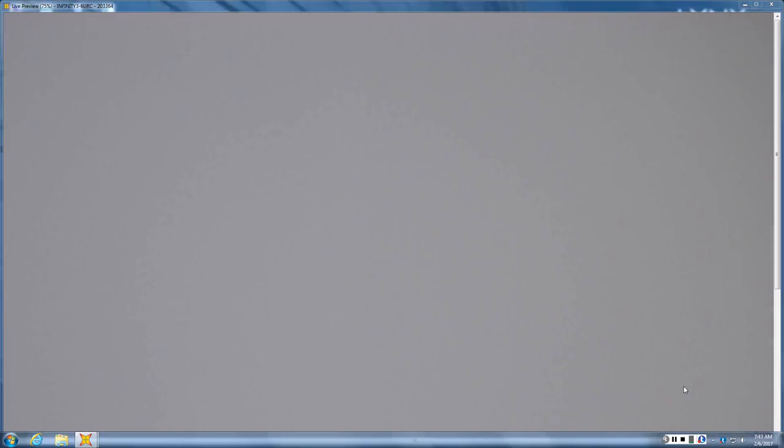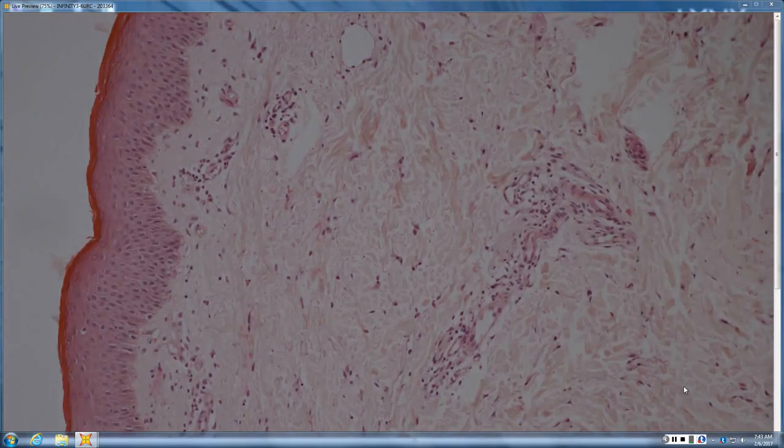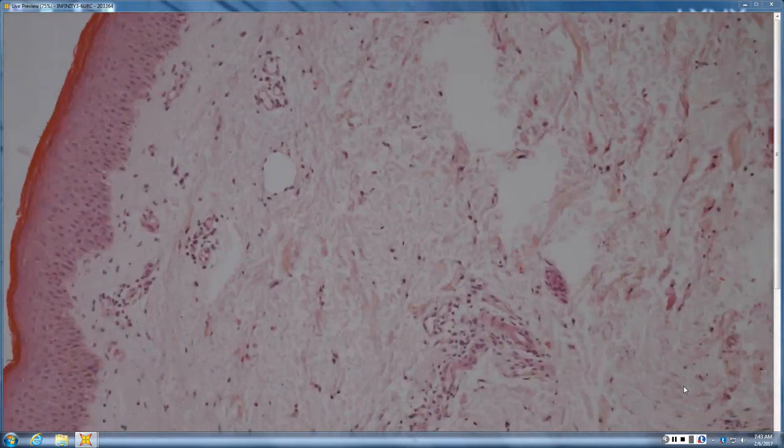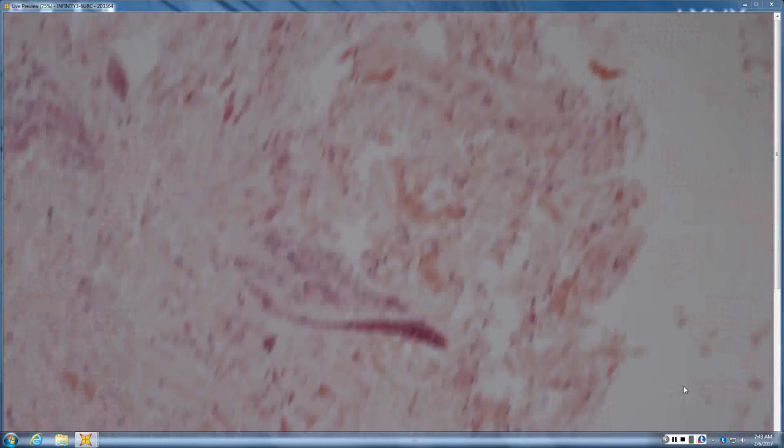But that is a good example of coccidioidomycosis with endosporulation. Very good. Well done.